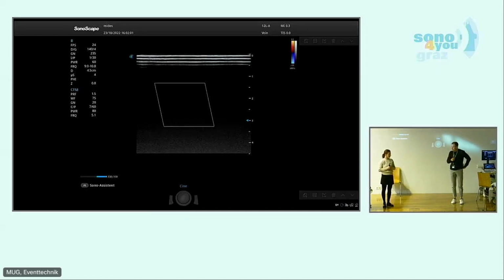When I have a patient that doesn't have anything, I can look at this leg in 5 minutes. When the patient has a body mass index of 35, the leg is swollen. You know how it is to touch this leg. You cannot compress it, and you are really fighting in the calf area to compress something.